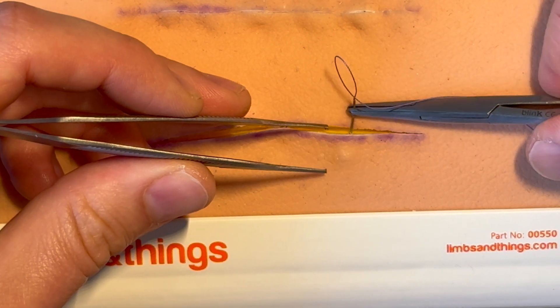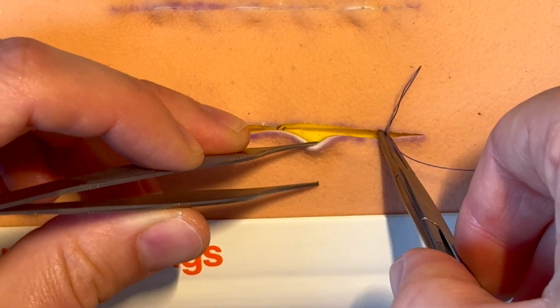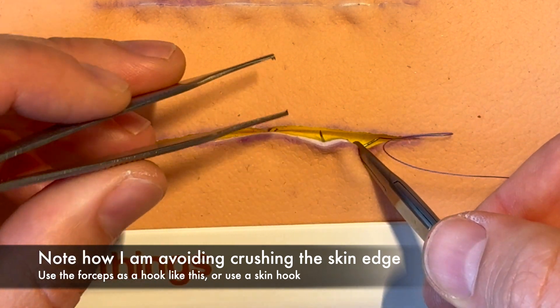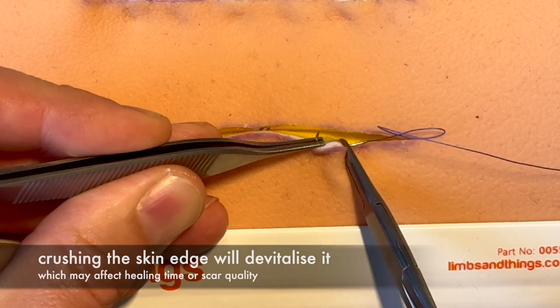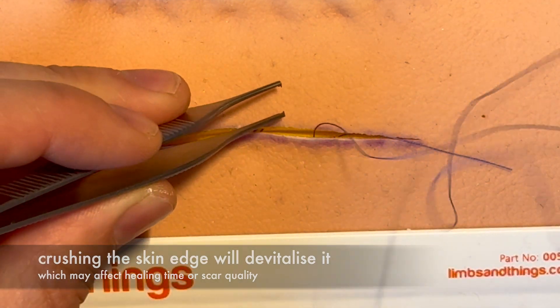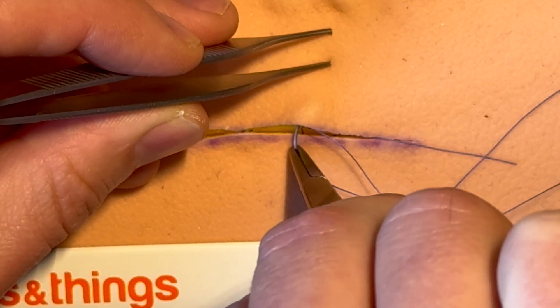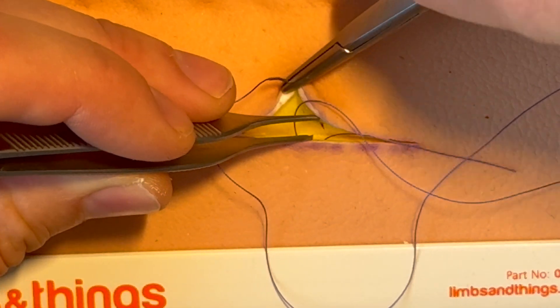Instead of trying to pull it back, the easiest way by far is to turn it a little bit and come slightly horizontal — that makes it an awful lot easier to get out through the dermis, ideally just subcutaneous. This also stops you from bending the needle, which will eventually snap. Pull it through again, then match the other side — go into the subcutaneous fat, get that dimple, turn it slightly, get a nice grab of the dermis, and come out just along a little bit.